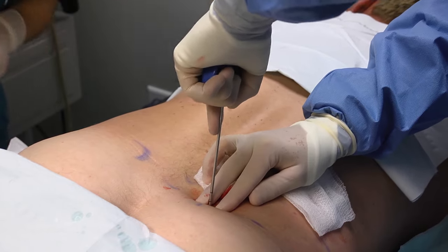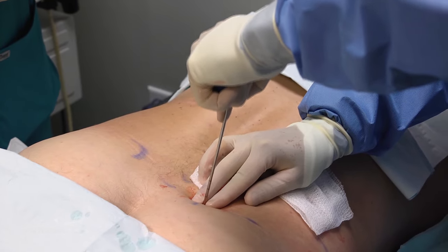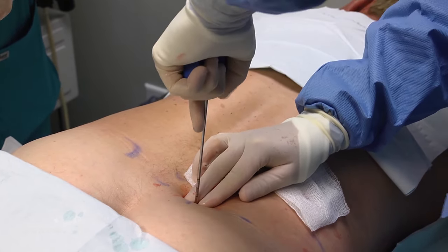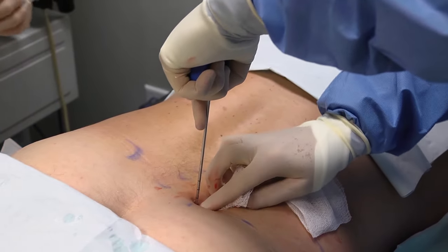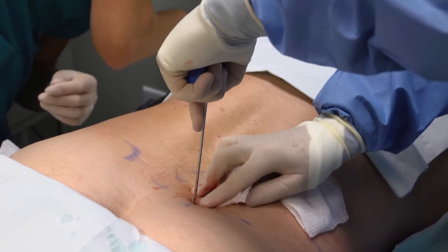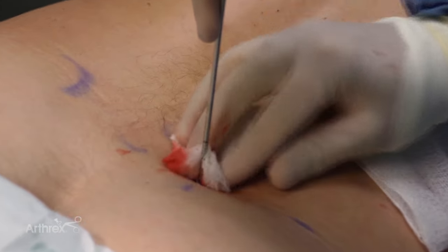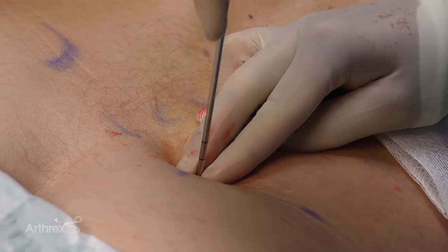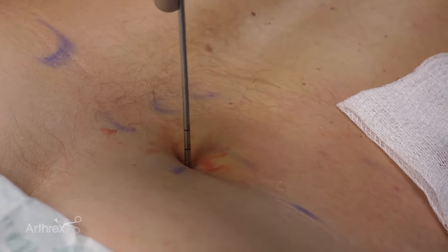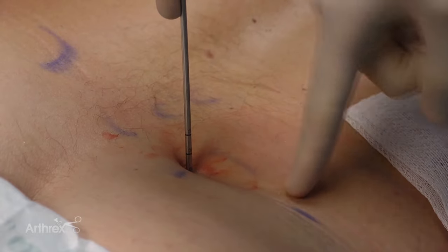I'm looking at his pelvis thinking his ASIS is right underneath my finger on the front of the pelvis about here. I just felt that I went through the cortex of the bone, and now I only have about a centimeter and a half of my line showing. I know I want to go at least two centimeters into the marrow space — there's one centimeter, two centimeters. We're going to start and get just a milliliter or two cc's, then turn our needle 90 degrees. I'll go three times around, then pull back about a half centimeter, and we'll do it again.